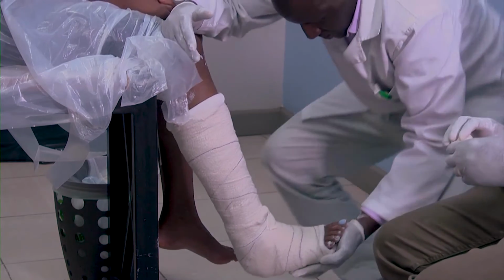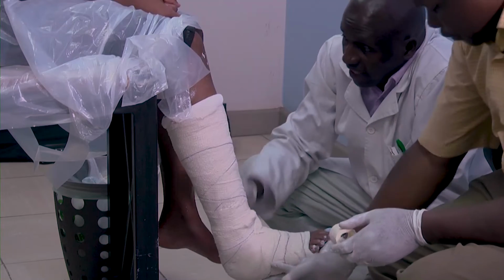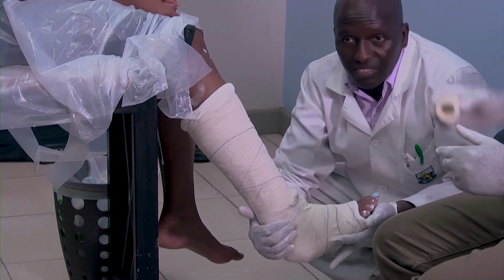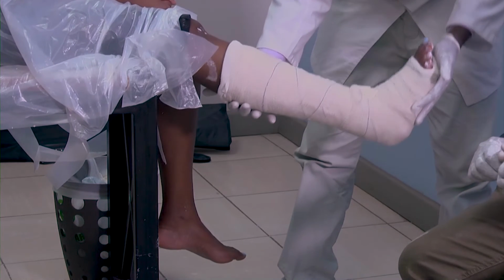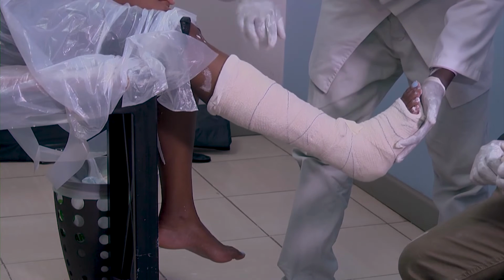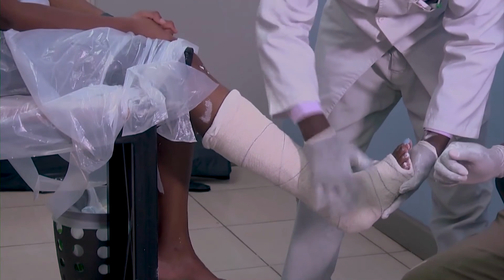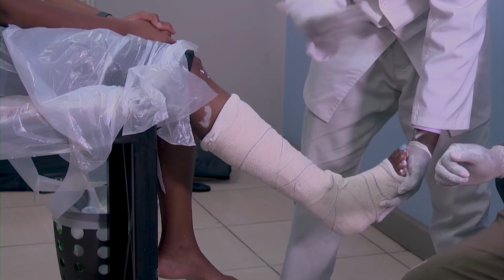So that is a below knee posterior slab. The patient is supposed to use crutches. Clean, wipe, and give instructions, because injuries around the ankle joint are prone to swelling. So we encourage the patient to elevate and exercise throughout because of the circulation. Then you follow up this patient until you're able to give definitive treatment.